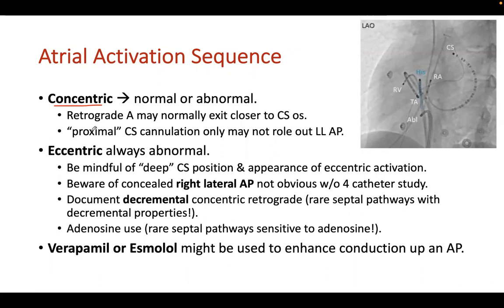Occasionally, normal individuals might have retrograde A that exits closer to the CS os rather than the HIS. Sometimes retrograde activation is normally at the CS os, not at the HIS, for specific people. Okay.